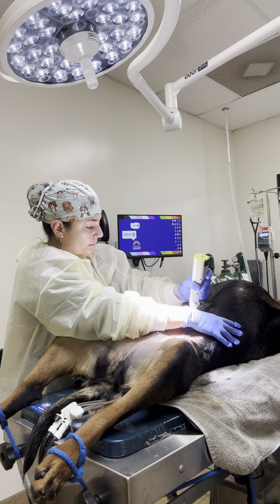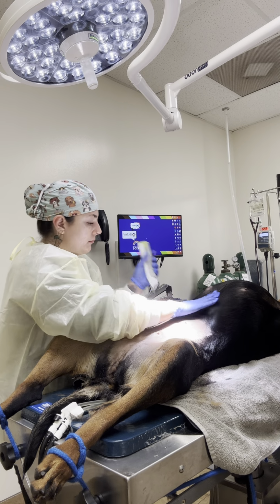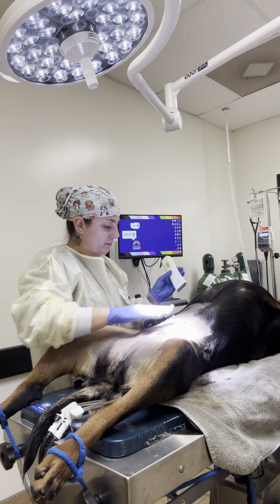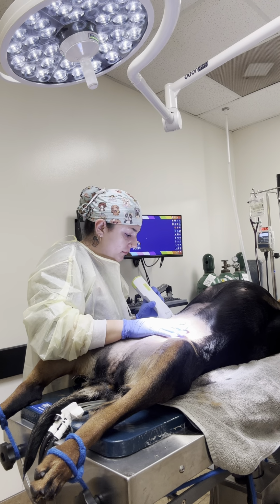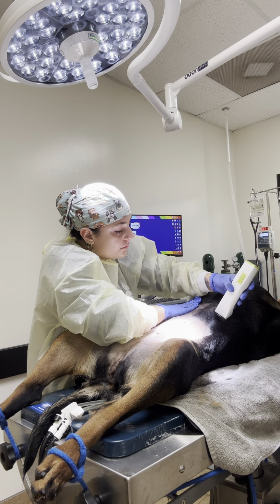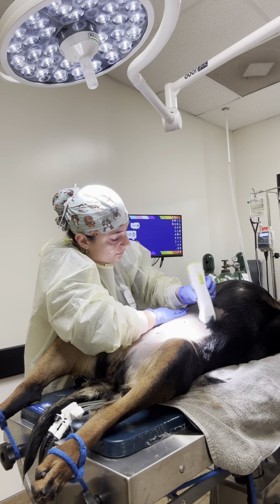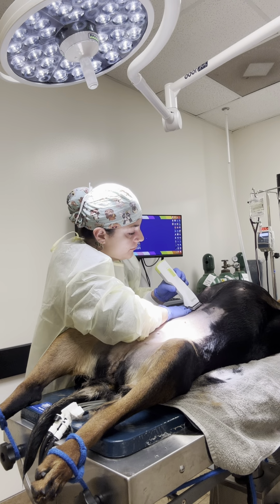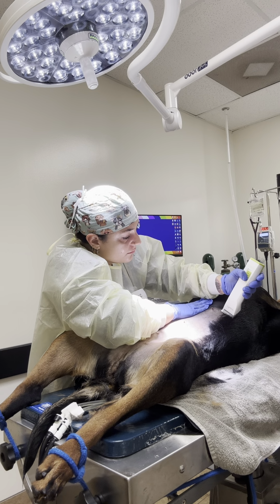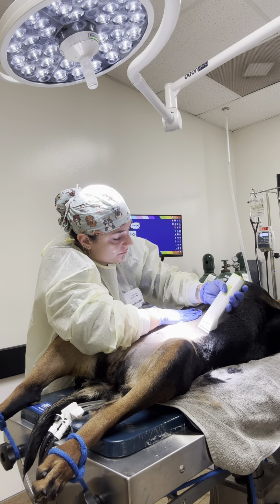So when I'm dripping for this, what I do is just stick it right in there and leave it in. Your fluid rate should be high enough that this stuff won't matter much. Okay. Yep, so I'll give like a half ml. And then as the heart rate starts to go up, you'll eventually increase your fluid rate.